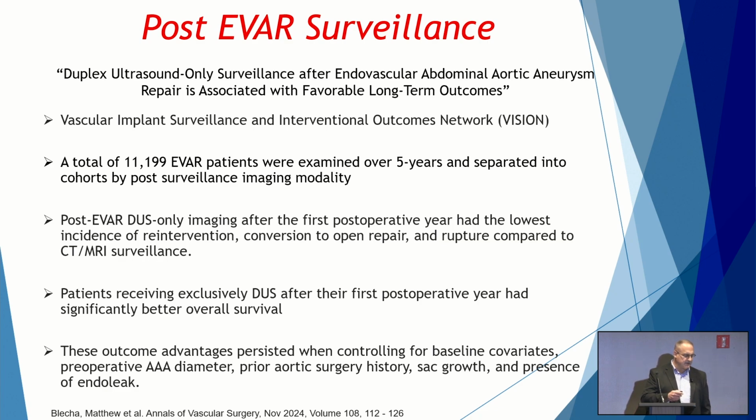They looked at over 11,000 patients and separated them into cohorts by post-surveillance imaging modality. They saw that the ultrasound-only cohort, after the first postoperative year, had the lowest incidence of reintervention, conversion to open repair, and rupture compared to CT or MRI surveillance. And they had better overall survival.